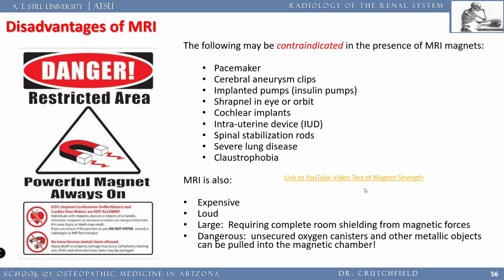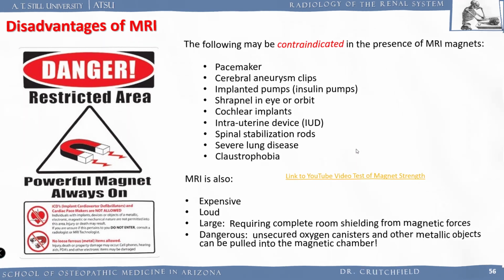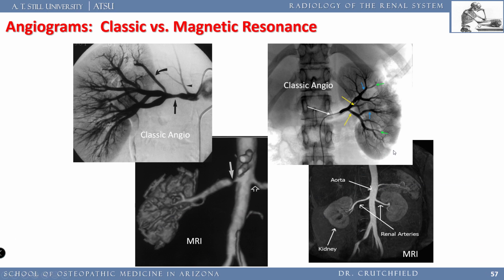So that just shows you how crazy strong those magnets are. So now let's talk about angiograms.